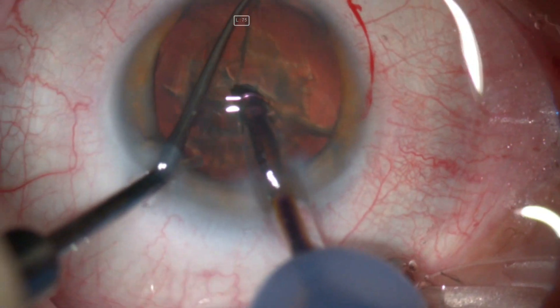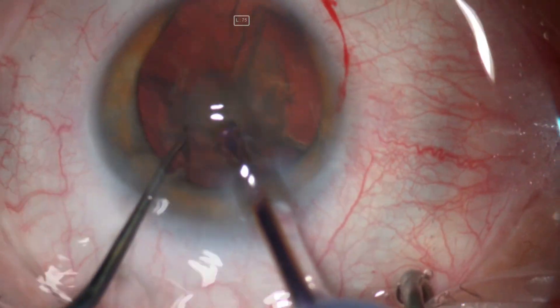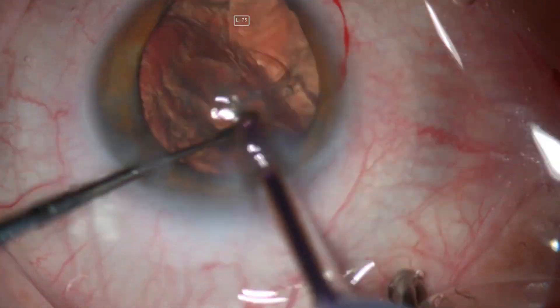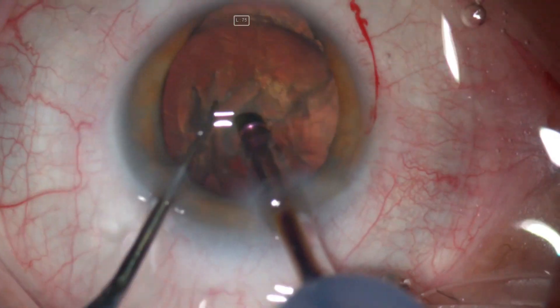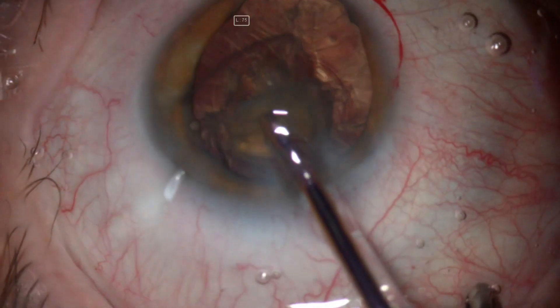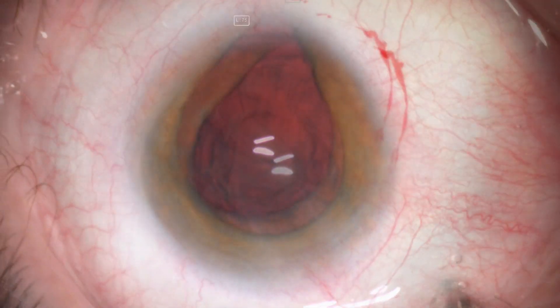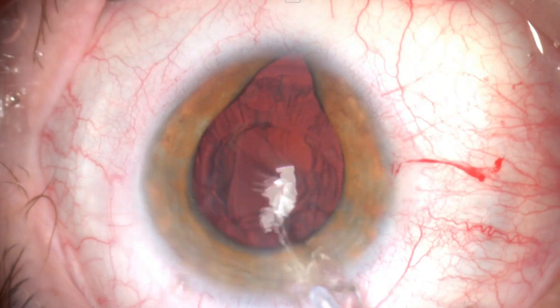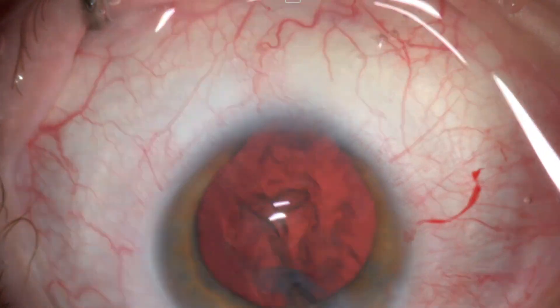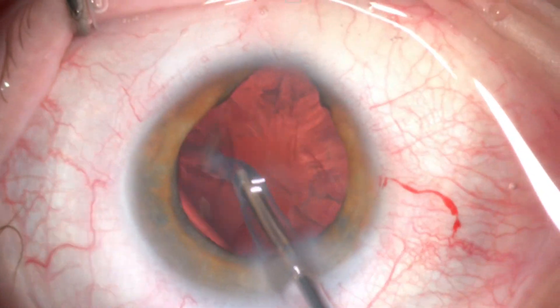Phacoemulsification was done using the stop and chop technique. The lens was divided into two halves, then chopped into quadrants. The quadrants were emulsified and then the remaining half was divided.